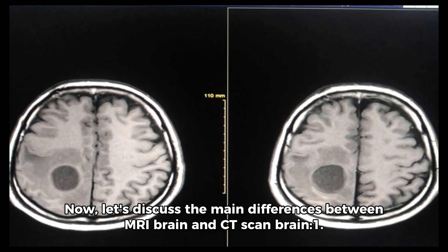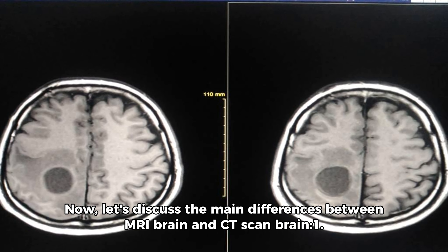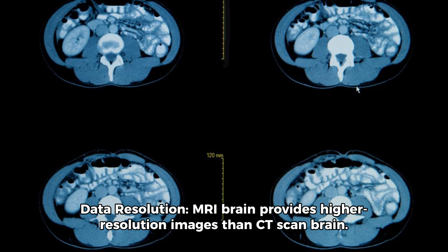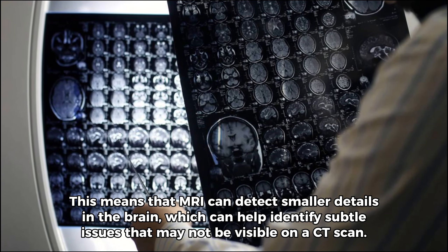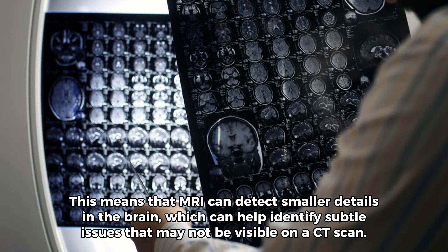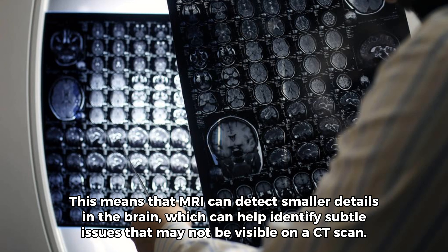Now, let's discuss the main differences between MRI brain and CT scan brain. First, data resolution: MRI brain provides higher resolution images than CT scan brain. This means that MRI can detect smaller details in the brain, which can help identify subtle issues that may not be visible on a CT scan.